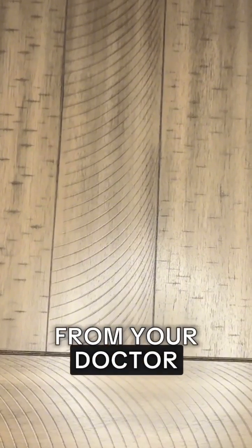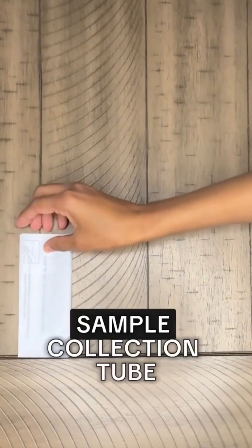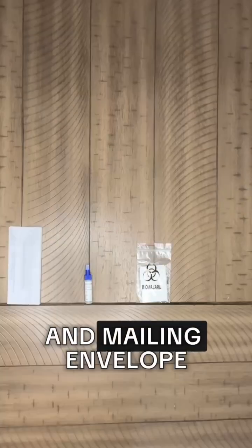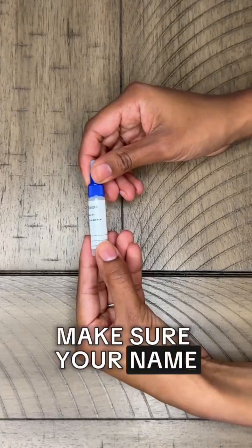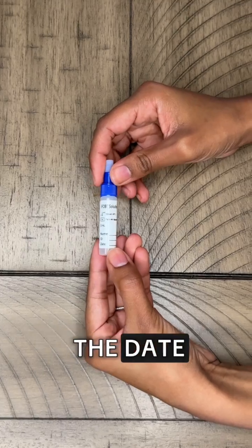Get the FIT test from your doctor. It comes with collection paper, a sample collection tube, a plastic bag, and a mailing envelope. Make sure your name is on the tube. If it is not there, write your name, date of birth, and the date.